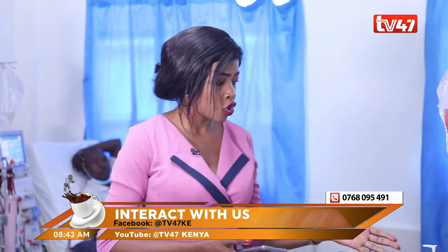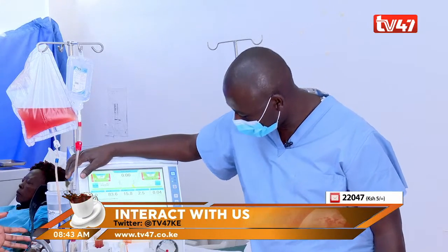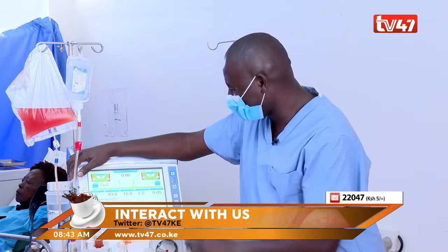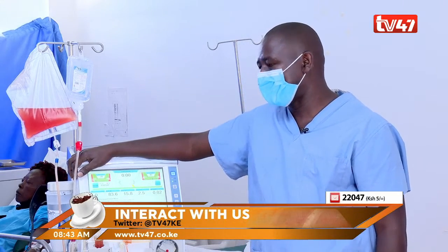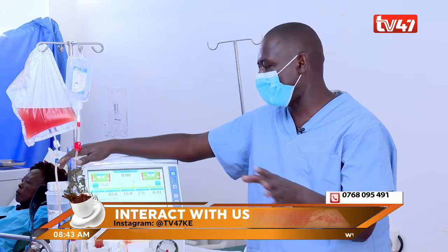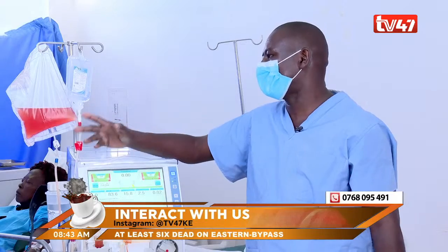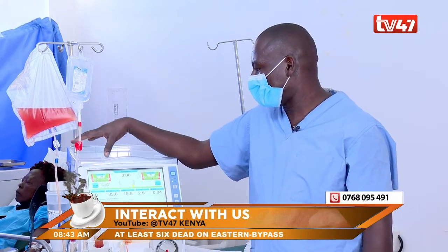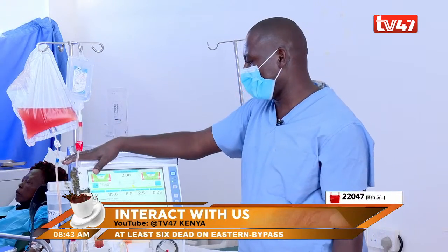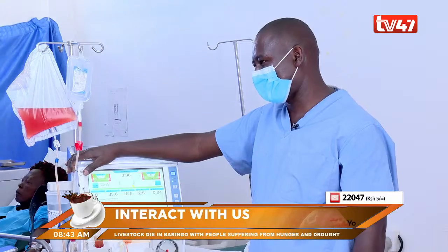Here we are, and this is the machine. This machine is called Cabro K-98. We have another one called Nipro. They're different types but they're doing the same thing. This is the machine which a patient uses for four hours of doing dialysis.